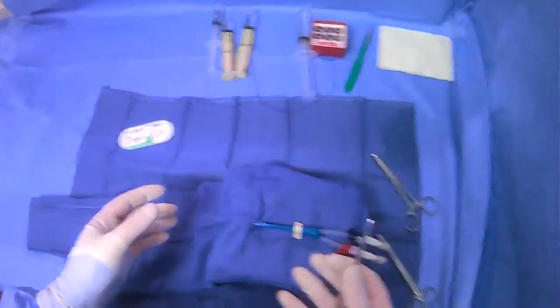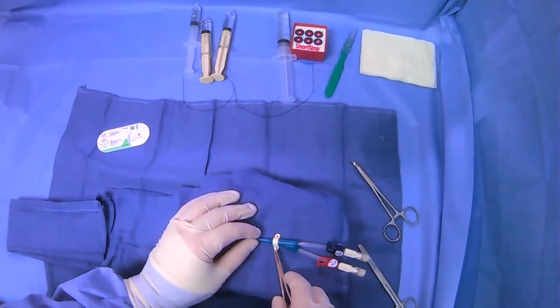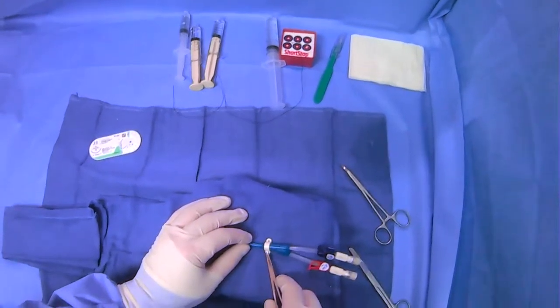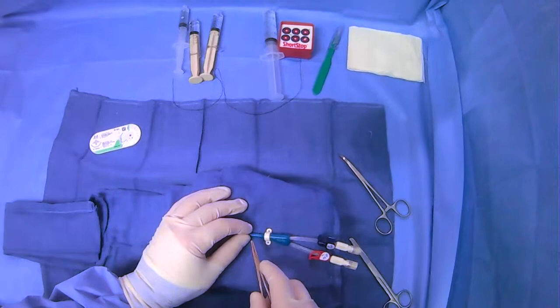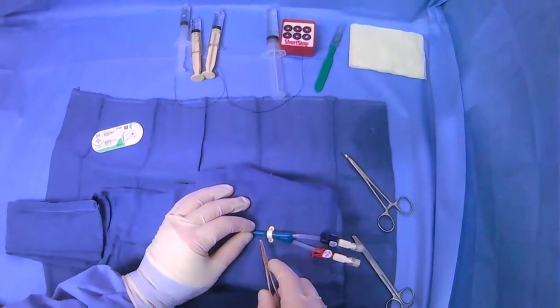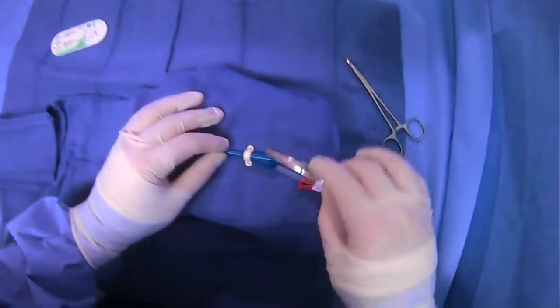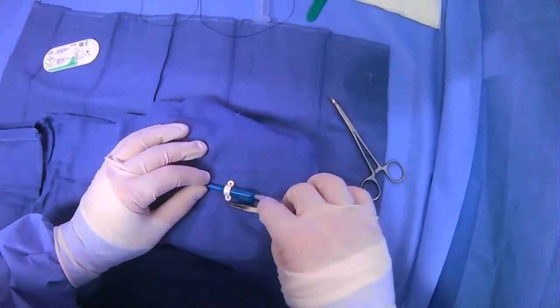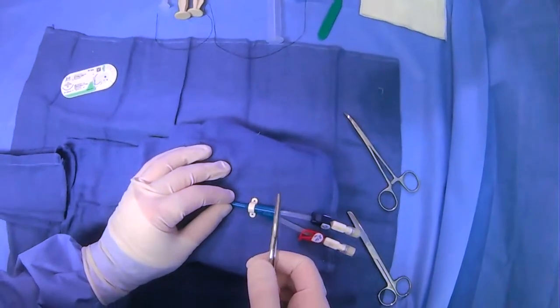Everyone has different preferences, and there are even different ways to actually suture using these provided areas, which I'll show you. Let's say we're going to do a suture technique where we do two air knots and tie around each hole individually. I'll show you how to do that here.